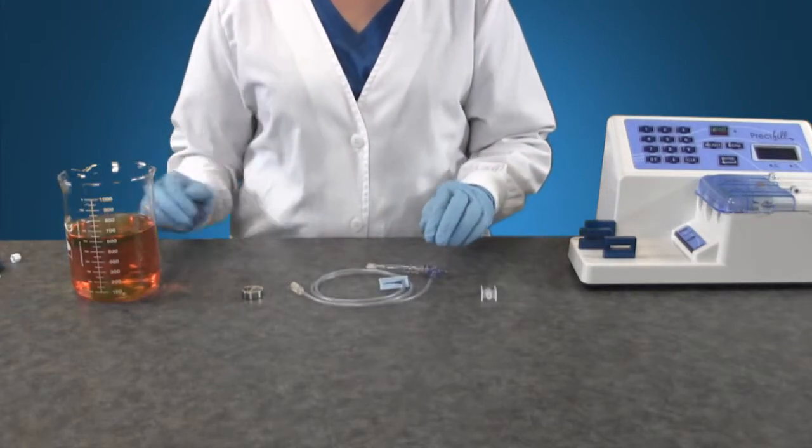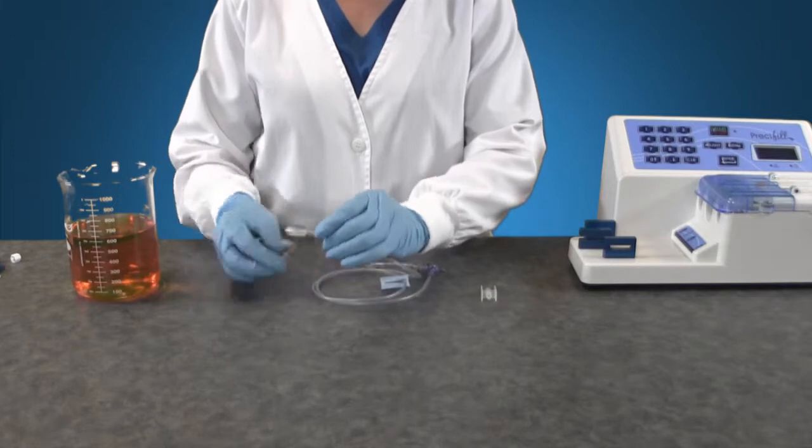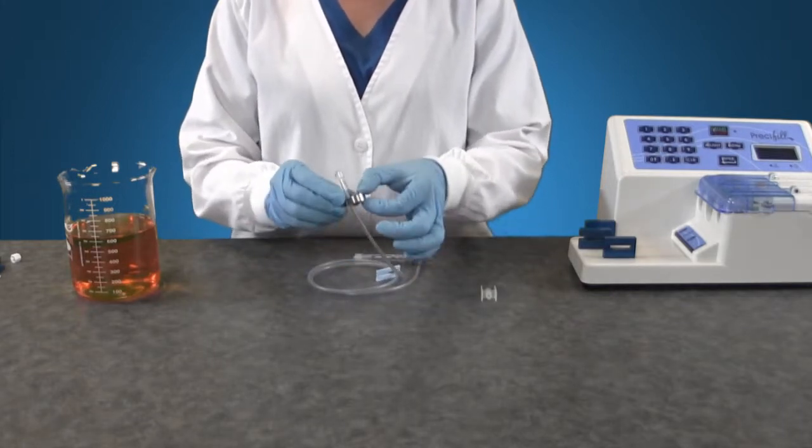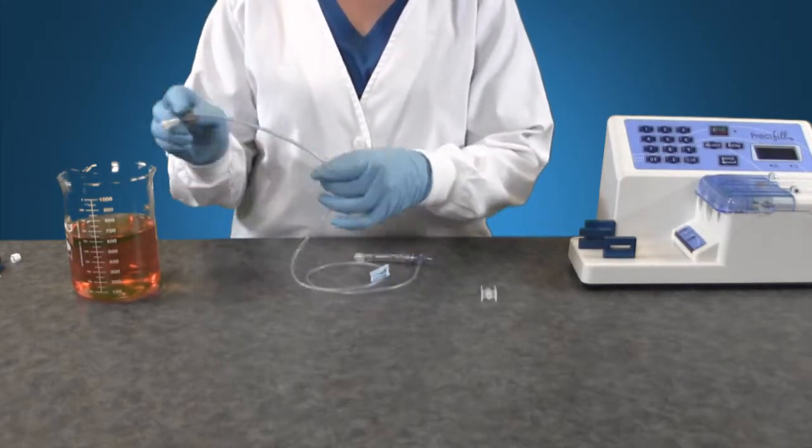Discard the three end caps as well as the white paper packaging. You only need the tubing set. Attach the metal anchor onto the long end of the tubing set and place into the glass beaker with the solution.